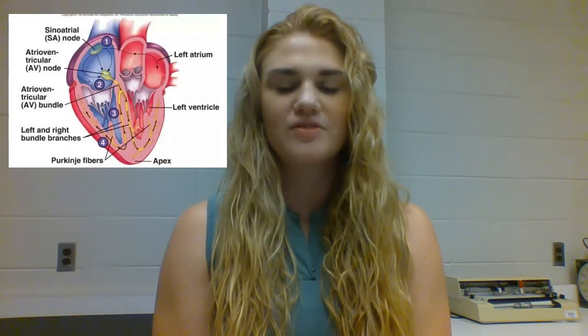The electrical activity, or movement of the ions across the cell membrane, can be recorded by the electrodes placed on the skin. During normal heart function, the electrical wave of depolarization is initiated by a special tissue called the sinoatrial node, or the SA node, often called the pacemaker of the heart. The wave then spreads in all directions of the atria, but also spreads quickly towards the left of the atria. When the wave of depolarization reaches the atrioventricular node, or the AV node, a brief pause in the electrical conduction occurs. This allows the atria to contract and push blood into the ventricles.